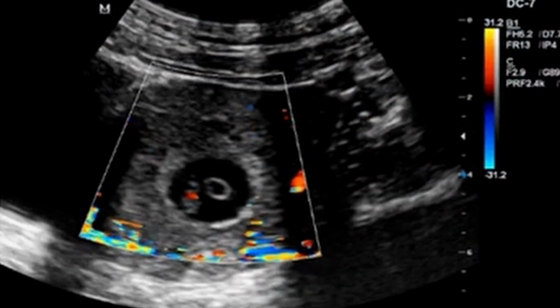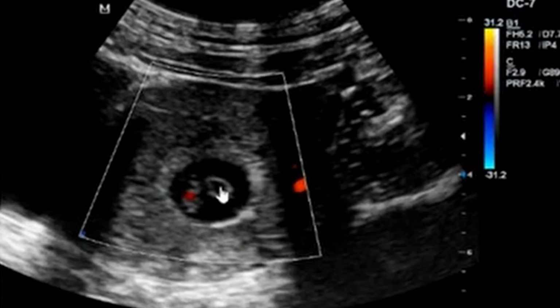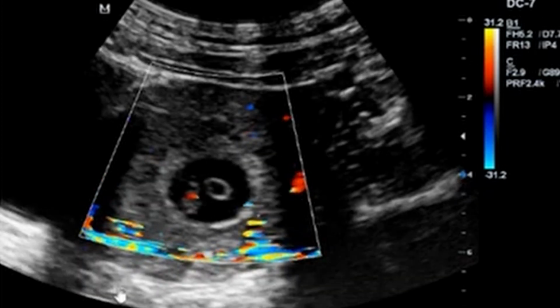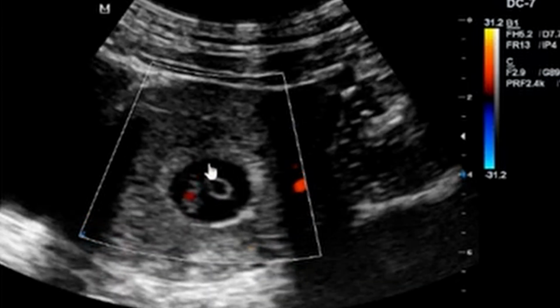Again, on color Doppler, you can visualize our yolk sac here. There's no perfusion here, and you can see the fetal pole. This is the heart flutter that you can see here. There is a flow of blood here, and then you can see flow of blood around the uterus. So this is our uterus, and then you can see the amniotic fluid that you have. You can see the heartbeat there, the heart flutter, to say this is a viable pregnancy, or the fetus is actually alive. There is no missed abortion.